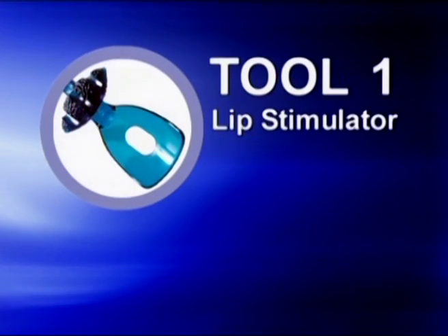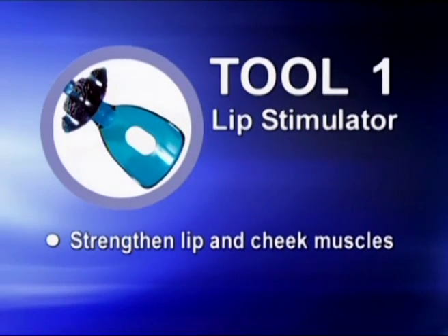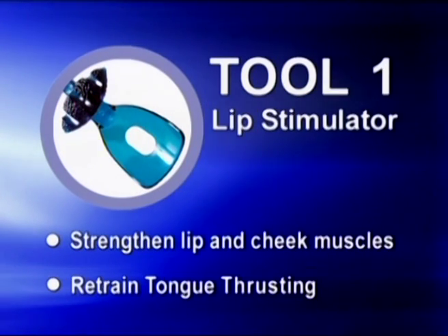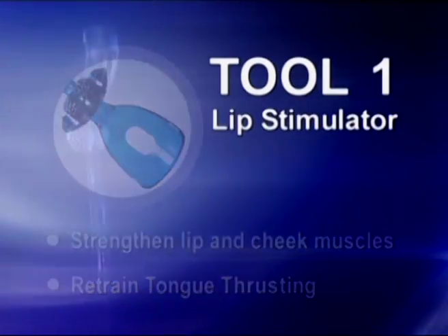Tool number 1 has 2 functions. One is to strengthen the lip and cheek muscles. The second function is to retrain tongue thrusting. Tool number 1 will help guide patients to position their tongue tip on the palate behind the front teeth, instead of thrusting their tongue between the lips and out of the mouth.